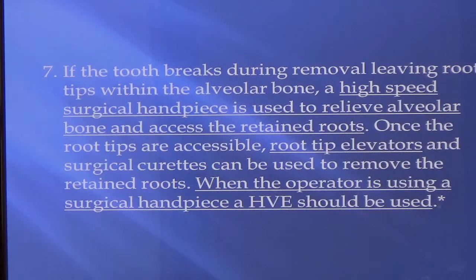Okay, so sometimes, especially here, there's only one room now that has 2 high volume evacuators. That's in one of my rooms. All the others only have 1. So if you're doing surgery in one of those rooms that only has 1 high-speed volume evacuator tip, then if the doctor switches to do a surgical extraction using a high speed, then you've got to switch from your surgical suction tip, switch that out to your regular high volume tip, okay?